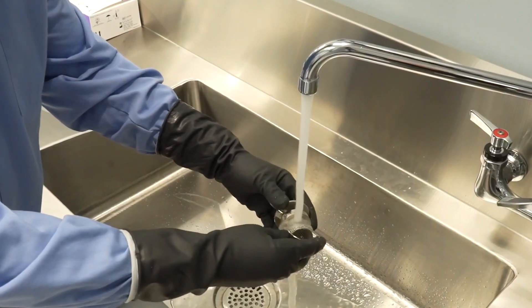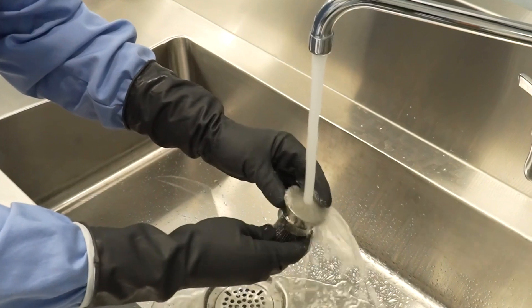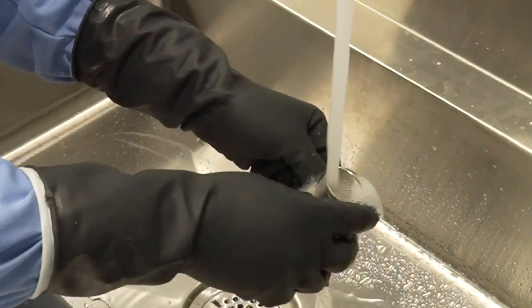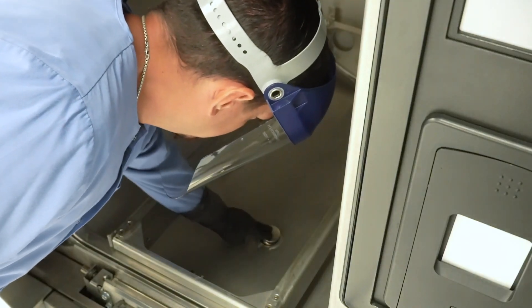Step 3: Remove obvious debris from the strainer and use a brush, wire, or similar tool to remove any remaining accumulation. Step 4: Once the strainer has been cleared, position the strainer upside down and under running water. Step 5: Replace the strainer in the chamber drain.